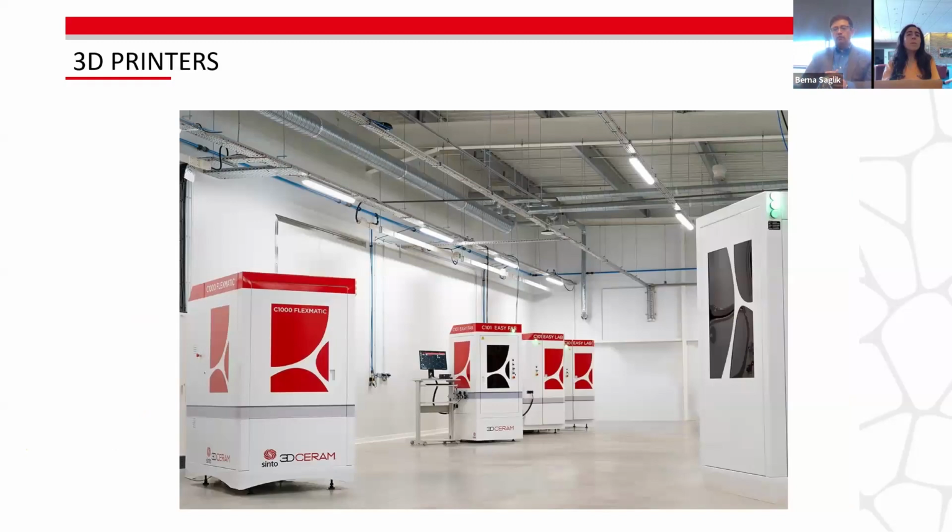So just briefly talk about the printers. We have 3 different sizes. There's a C101, which is what we use for Dr. Al-Rashdan samples, Dr. Zandi's samples, mainly use the C101 lab or the C101 fab. This is something for the university level use, occasional sampling.